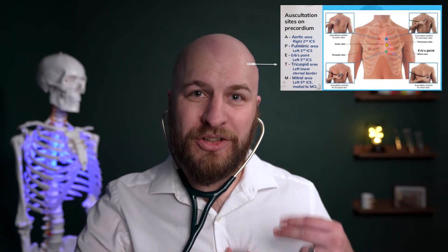Now if you move down one more intercostal space — so you should be between your fourth and fifth ribs — that's where you're going to hear your tricuspid valve, which is the valve between the right atrium and ventricle.